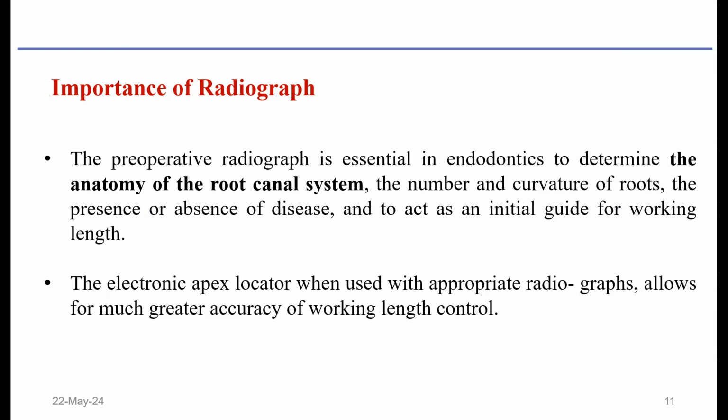The importance of radiograph: the preoperative radiograph is essential in endodontics to determine the anatomy of the root canal space. Even though we say that radiographic assessment may not be accurate all the time, you cannot completely ditch the radiograph system, because it helps you analyze the root canal space. How many canals are there? Is there a curvature? Is there a deep split in the root canal system, or a calcification, or a lesion? So you cannot always avoid a radiograph.